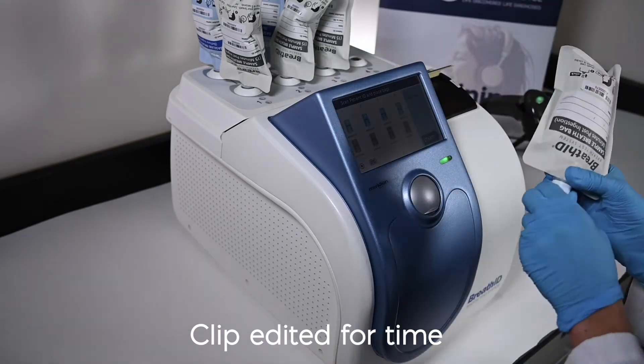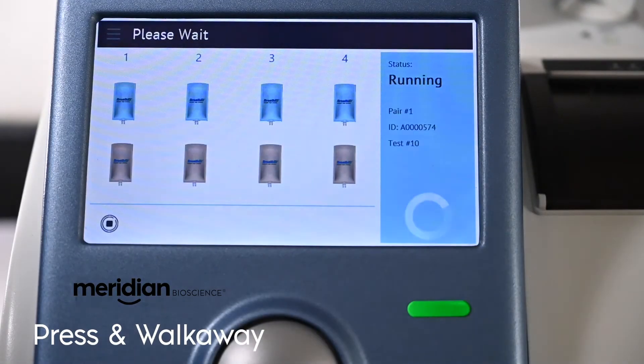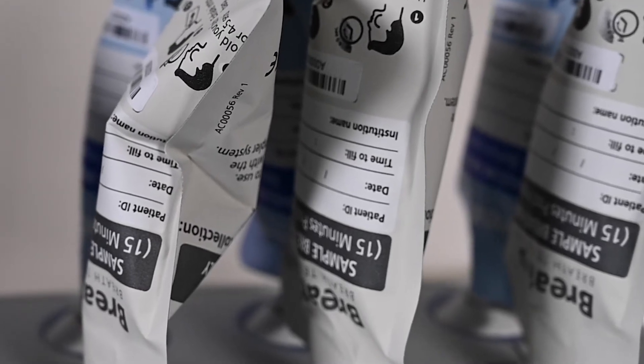Once all the bags have been loaded, press start on the main screen. At this point, the user can walk away as the batch is running, since error handling will be postponed until the completion of the batch. This creates a seamless workflow as there are no batch interruptions or delays in reporting the result.